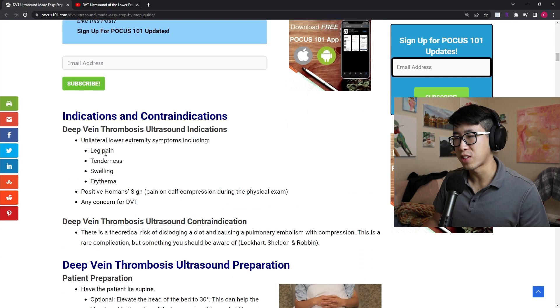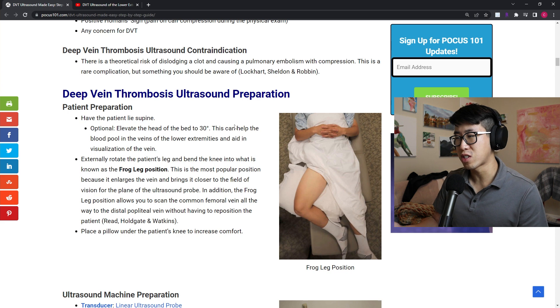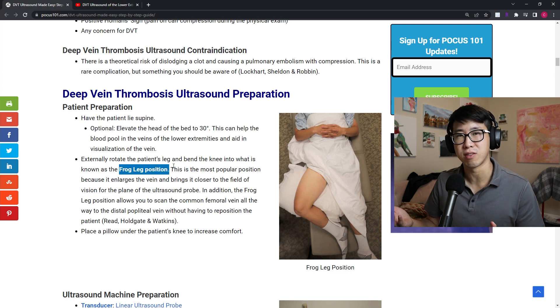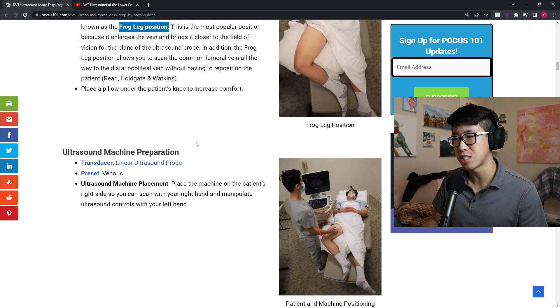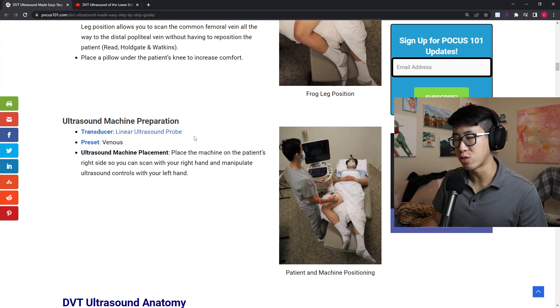They go over some of the indications for doing a DVT ultrasound. First, you want to put the patient in a frog-like position — this is really going to help bring the veins closer to the surface, help distend them a little bit, and make them easier to visualize. Then we're going to start with the linear ultrasound probe.